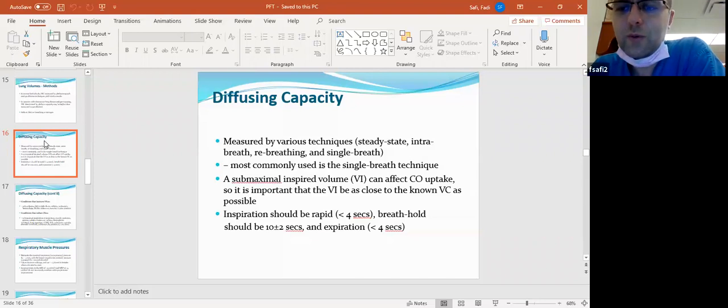That's why we have carbon monoxide poisoning with a small amount of carbon monoxide. In the pulmonary function test lab, we give trace amounts, very small amounts of carbon monoxide. We give it to inhale, and we ask the patient to hold his breath for 10 seconds. Why do you hold your breath? Because you want the gas to diffuse quickly. Now, what you expect is that all the amount of gas that you give should diffuse.